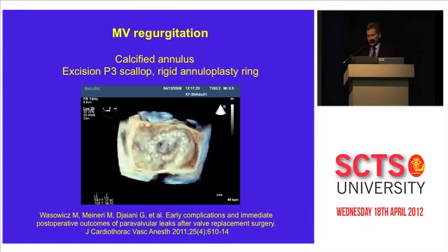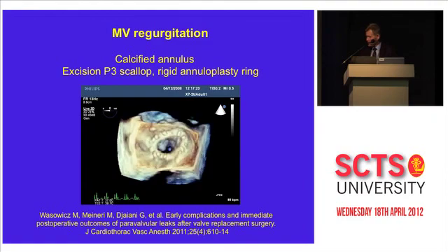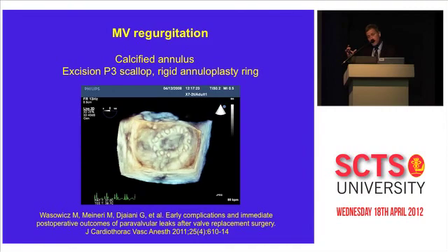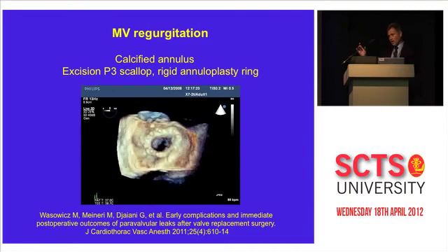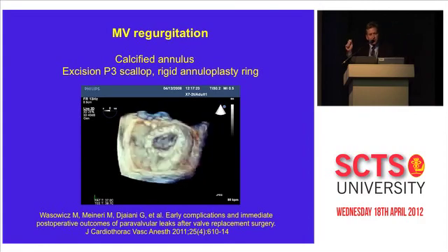and afterwards I saw this. And when I pointed this out to him, and the remaining calcium there on the annulus, he said, yes, but it was very calcified. He didn't want to cause damage, so he put the annuloplasty band or ring almost onto the posterior leaflet rather than on the annulus. So it was very rigid.